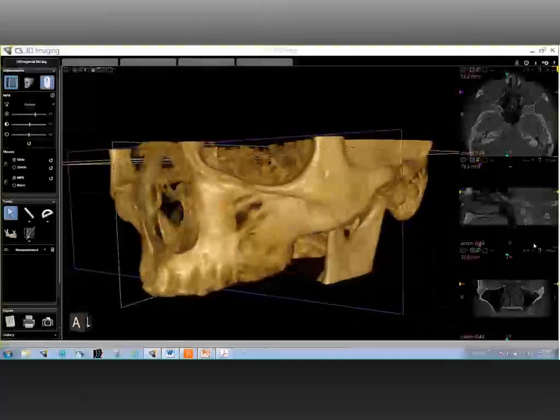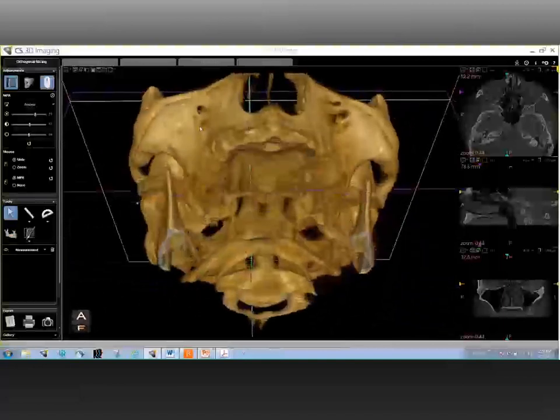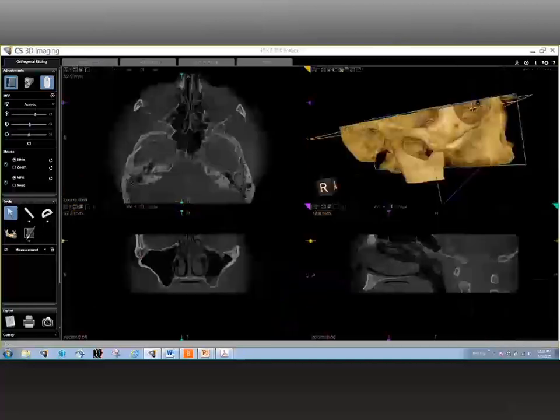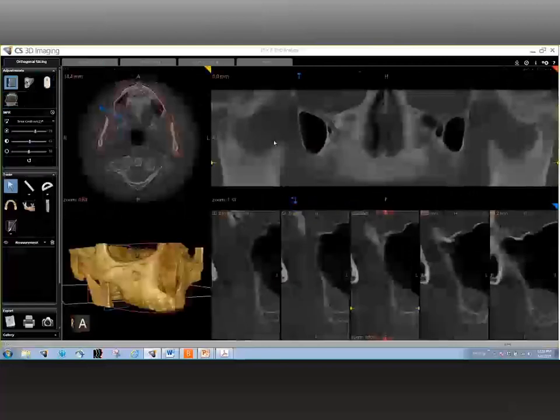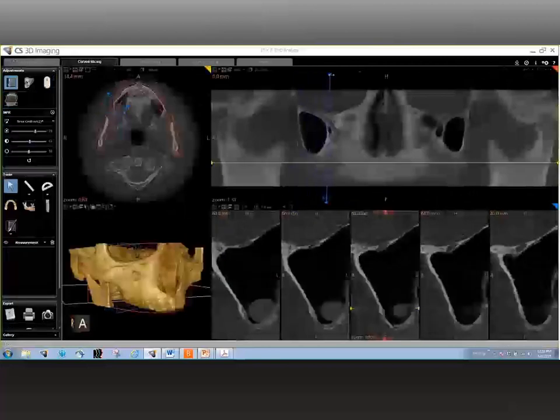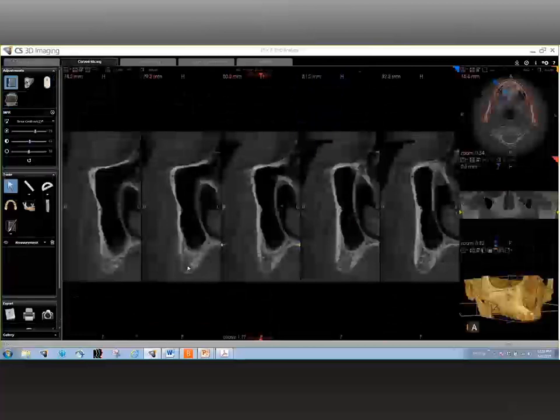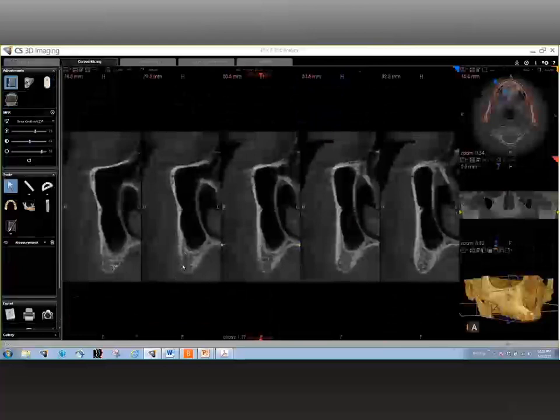What are the most commonly visualized anatomical structures in the maxillary region? Well, Jordan, that is a fairly simple question. As with any other hard tissue, one of the most commonly visualized anatomical landmarks is the cortical bone — we are looking at the integrity of the cortical bone. Then the cancellous bone, which is within the cortical bone, and the trabeculation pattern within the cancellous bone, which signifies the health and density of the bone. Traditional methods of evaluating bone density do not apply here, so it's a little bit different criteria.